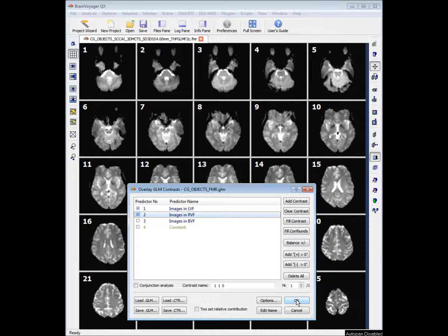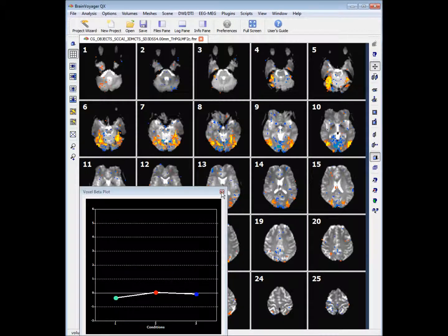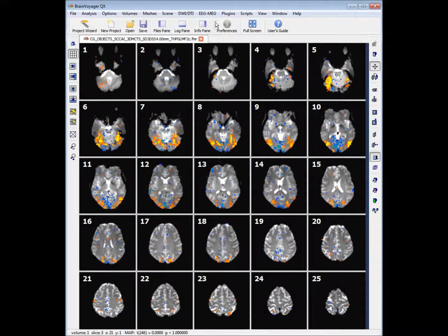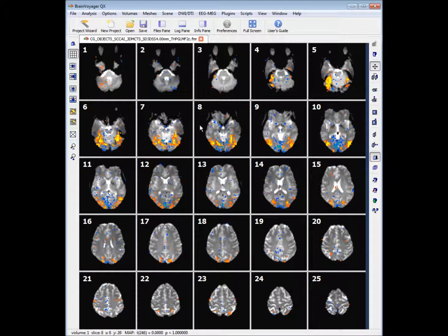We can close the voxel beta plot. We have our GLM contrast overlaid on our slices.